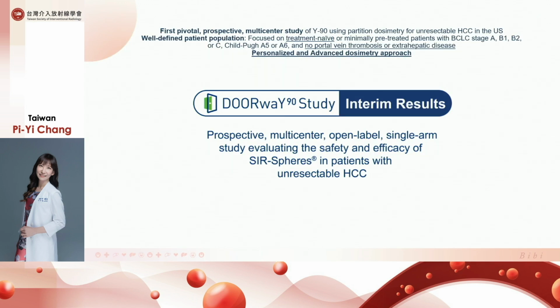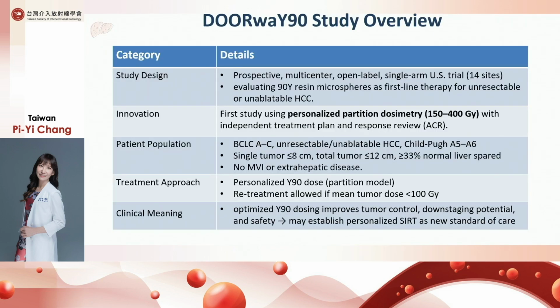Then this is the most important part of my sharing, where I'm going to share the DOORWAY Yttrium-90 study because it's just launched recently. For the DOORWAY Yttrium-90 study, the study design is prospective and multi-center, at about 14 sites, evaluating Yttrium-90 resin microspheres.